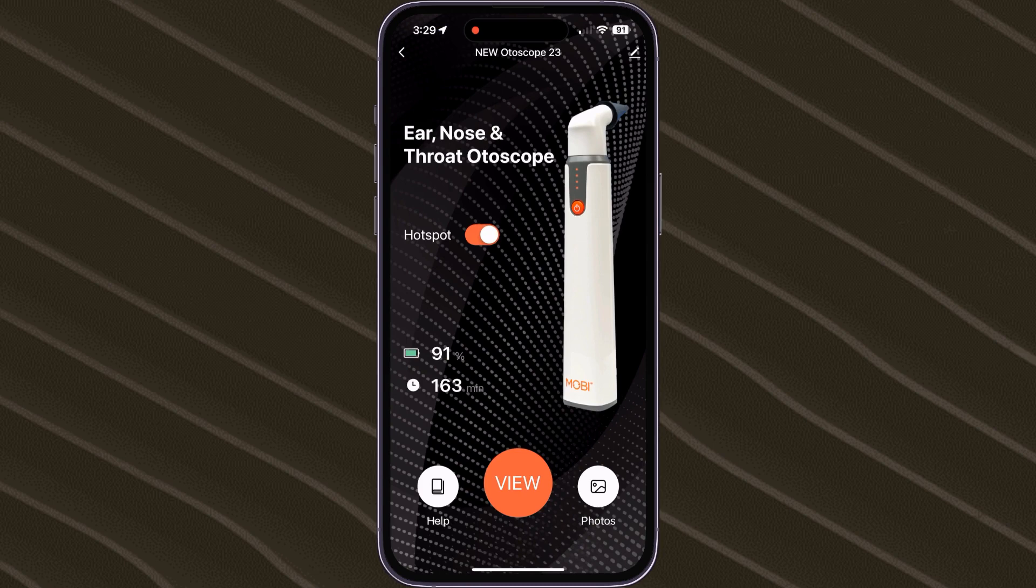Once the status bar switches to orange, tap on the View button and your Otoscope is now ready to use.